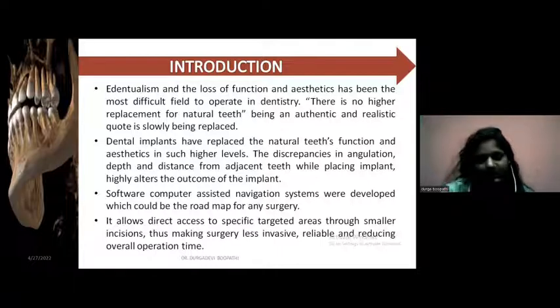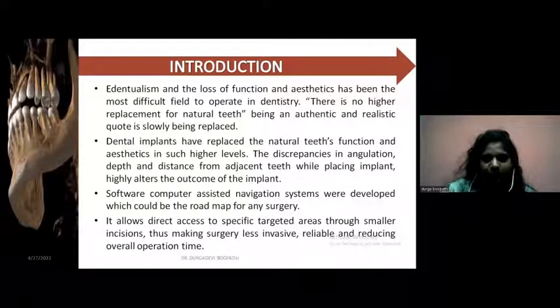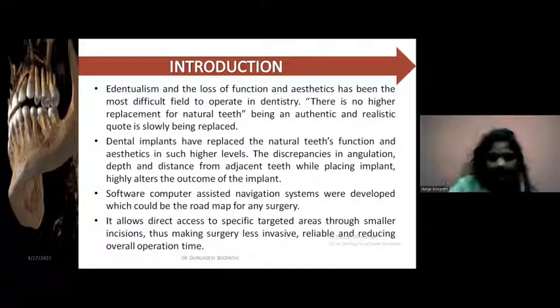And yes, it is. But of course, things which give that much result, the success rate also depends on many things. The discrepancies in the angulation, depth, and distance from the adjacent teeth while placing an implant highly alter the outcome of the implant. And that's where software computer assisted navigation systems were developed, so that it could be a roadmap for any surgery. It makes the surgery less invasive, reliable, and reduces overall operation time.